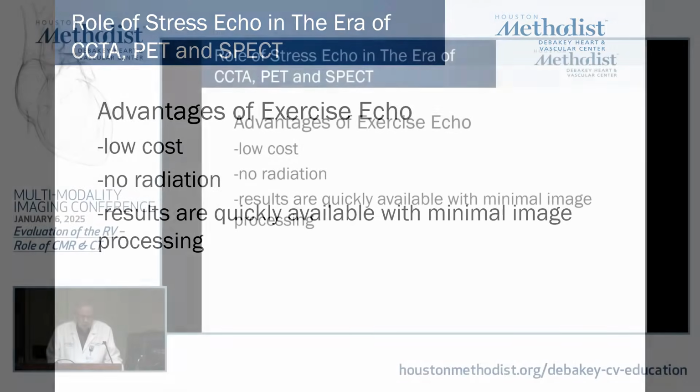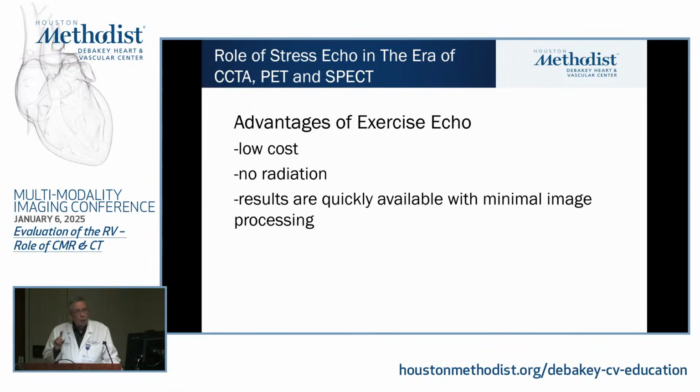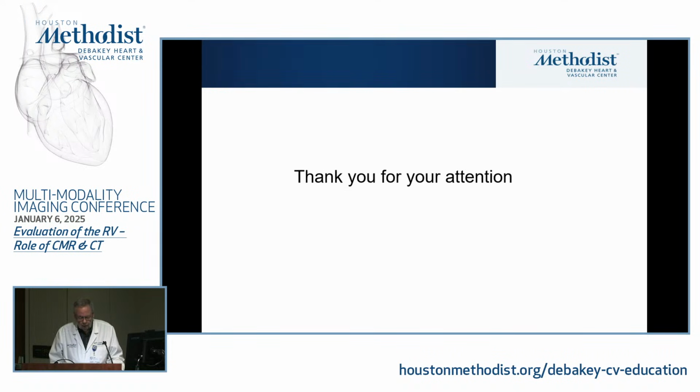So the advantages of stress echo: low cost, no radiation, and also a very important thing, you get results right there. You don't have to do a lot of processing. You take a look at your result right there, and you can write your report. You don't have a lot of post-imaging processing that you have to do.